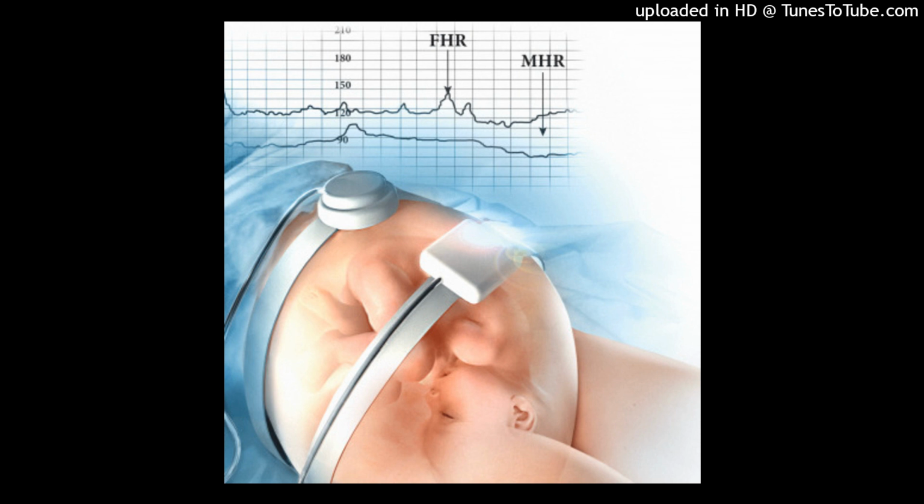Figure 14.9. Absent variability, amplitude range visually undetectable. Minimal variability, amplitude range visually detectable, but 5 bpm or less. Moderate variability, amplitude range 6 bpm to 25 bpm. Marked variability, amplitude range greater than 25 bpm.